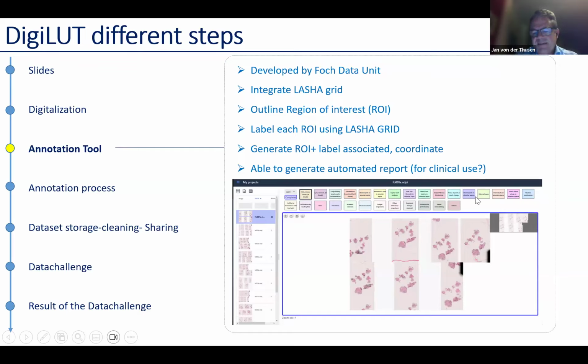So I think that creates a problem for the data scientists, in that we have a problem which consists of over 20 different phenotypes that we can annotate. Then this allows us to draw a line around a region of interest, which then incorporates one of these features. That's used by then clicking on the button above the screen and annotating it with the relevant label.